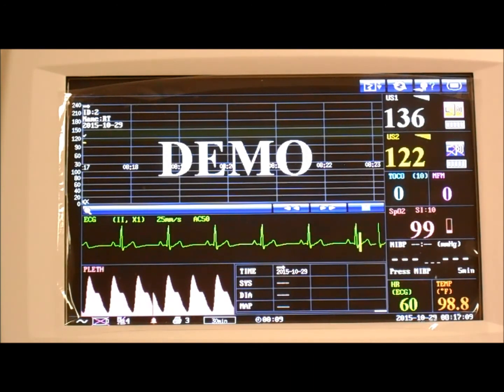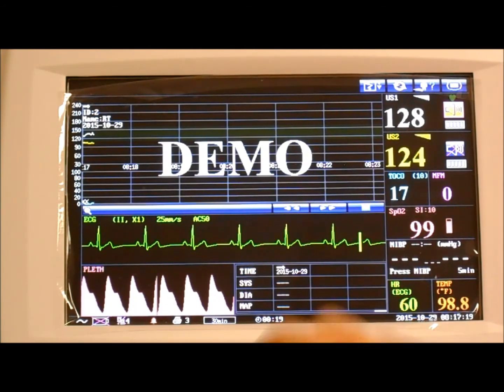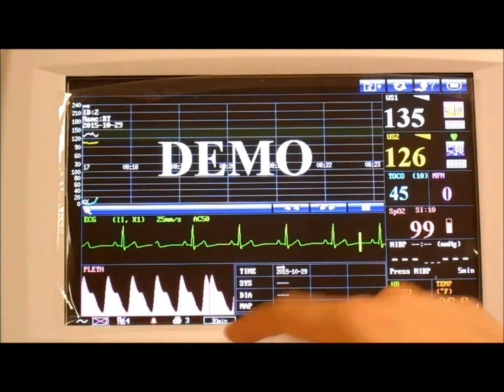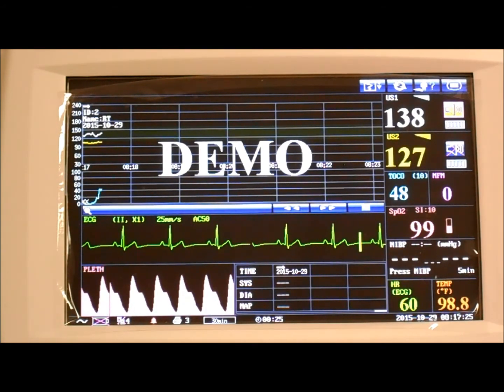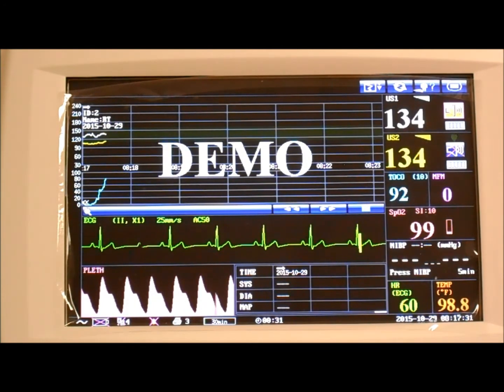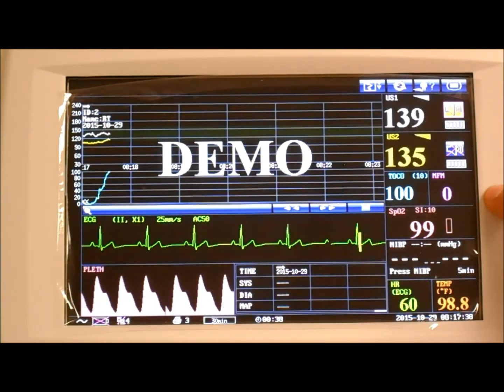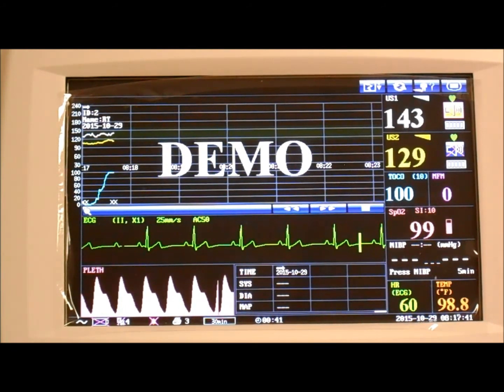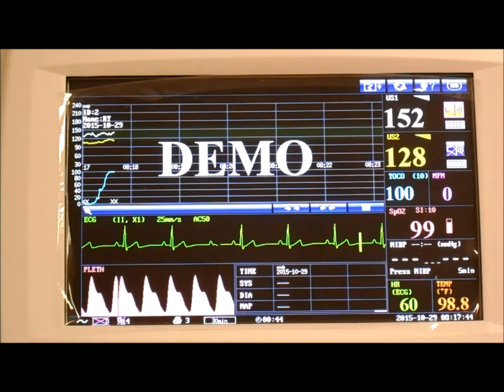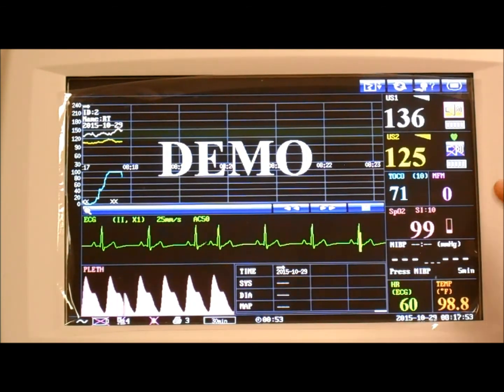So it's that simple. Place the transducer on your patient, press the start key to start a new session. The system will automatically ask you to enter the information, and it'll start printing for 30 minutes or depending on your preferred setting. And that's it. You press the silence key to mute any alarms. If the Toco transducer accidentally falls, you place it back on your patient. You press auto 0 to set it back to the baseline, because when you press the start key, it also does the auto 0 command by itself. You only do the auto 0 if it falls during a session, so that you don't have to start all over, and you can bring the Toco back to baseline.